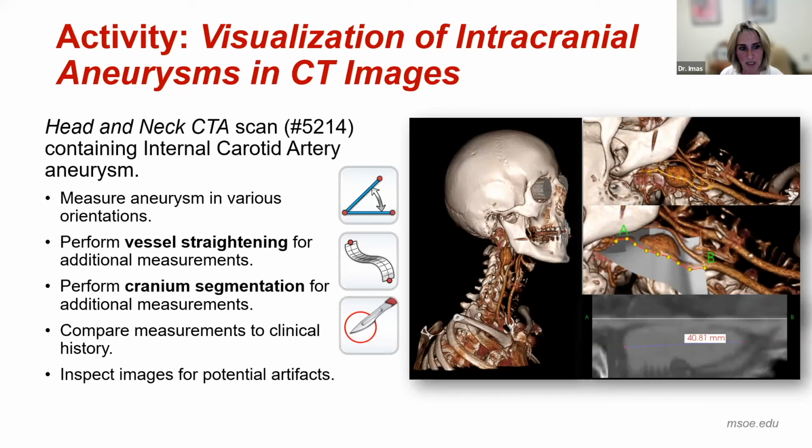Then I also asked the students to use the cranial segmentation tool, and that's the little dissection tool with a red circle. You see, that's the third bottom icon. This one is specific to sets that are head and neck sets, so that there is cranium to segment. And it's really perfected for those cases.